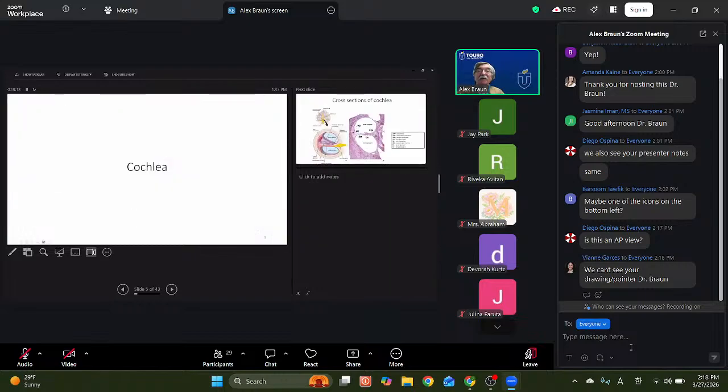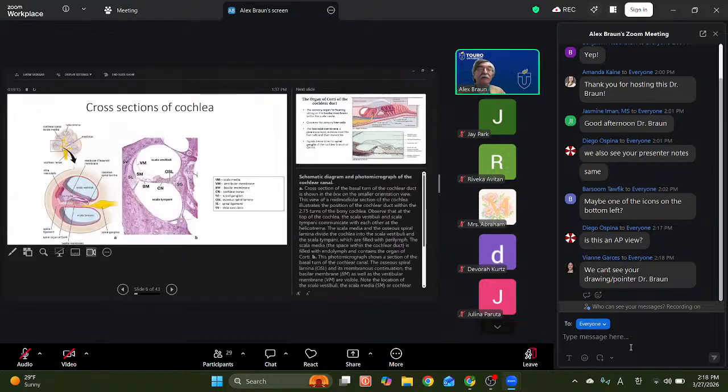Let's talk about the cochlea a little further. If you take an ear and transect it, the inner ear that is, you see the cochlea. This is what the cochlea looks like on transverse section. Actually, the cochlea externally looks like a snail. It's a longitudinally oriented tube that spirals around itself, forming about 2 3/4 turns.